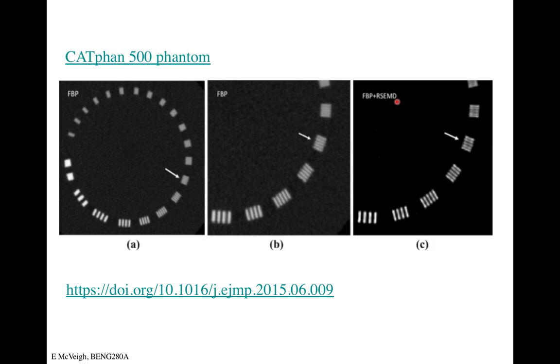And as you push the patient towards the detector, blur is essentially what your spatial resolution will be limited by, right? When you push them towards the source, the spot size will cause a larger blur, and so you just put them in the middle, right? And you use a spot size that's about the size of your detector. That's usually how they do that.